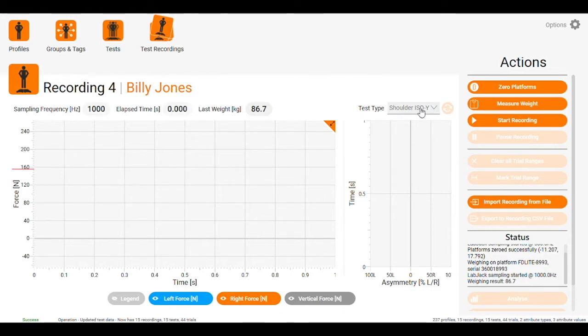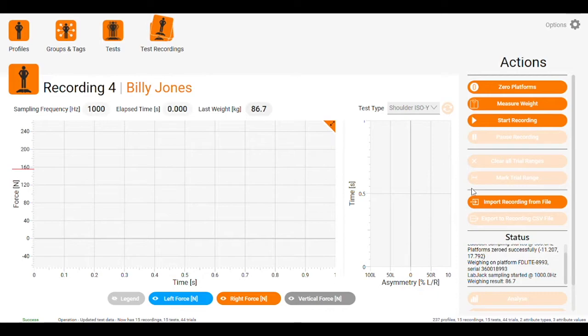For any other isometric test, we select general force time analysis.